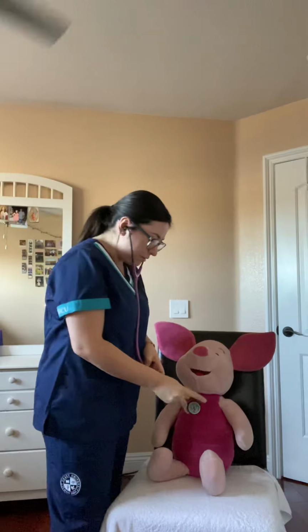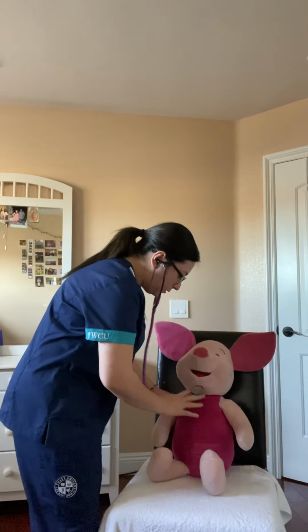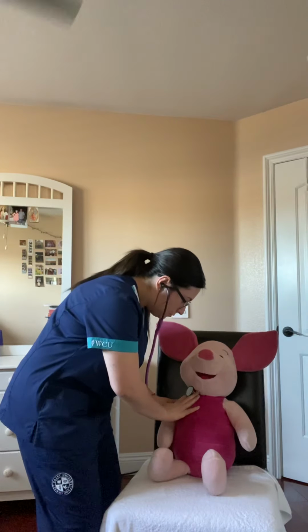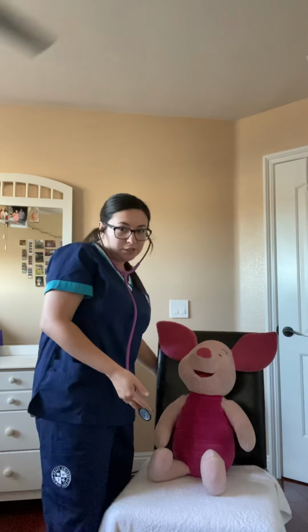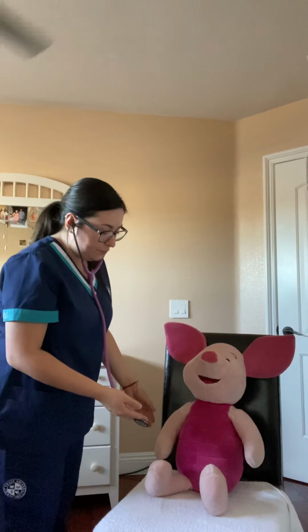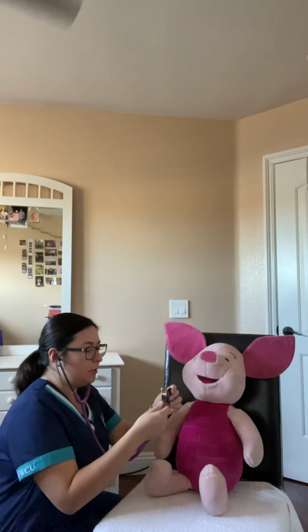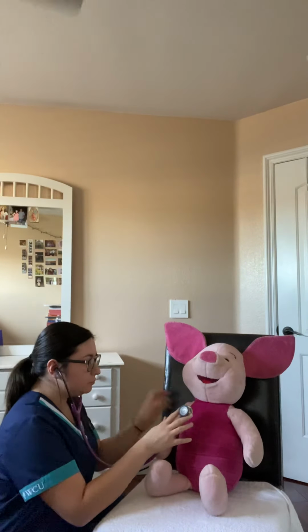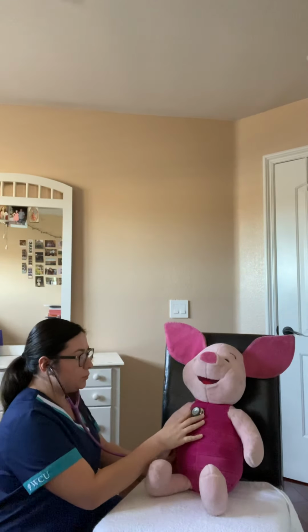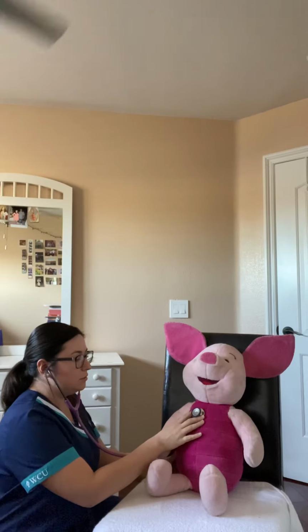Okay, so my bell is on. Go ahead and hold your breath. Okay, hold your breath. Good. So there's no bruit. So since I do have my stethoscope, I'm going to be auscultating the heart sounds of the patient. So I'm going to go ahead and turn my diaphragm on. Okay, so the first one I'm going to be on the right side, second intercostal space, and that's the aortic.